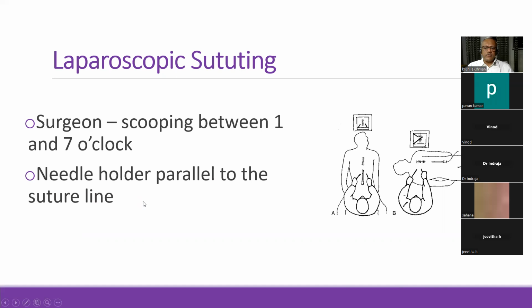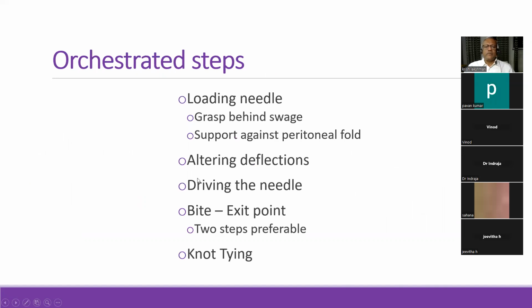And the needle holder must be parallel to the suture line, which means the needle, which is mounted perpendicular to the needle holder, will be perpendicular to the suture line. Okay. And if we are looking at suturing, I'll tell you for the sake of saving time, because suturing is a thing that can be learned with effort, but you need to have the principles in mind. It has to be, as people say, like an orchestrated movement in a dance, as it were, steps 1, 2, 3, 4, 5, 6, 7, 8, like that.